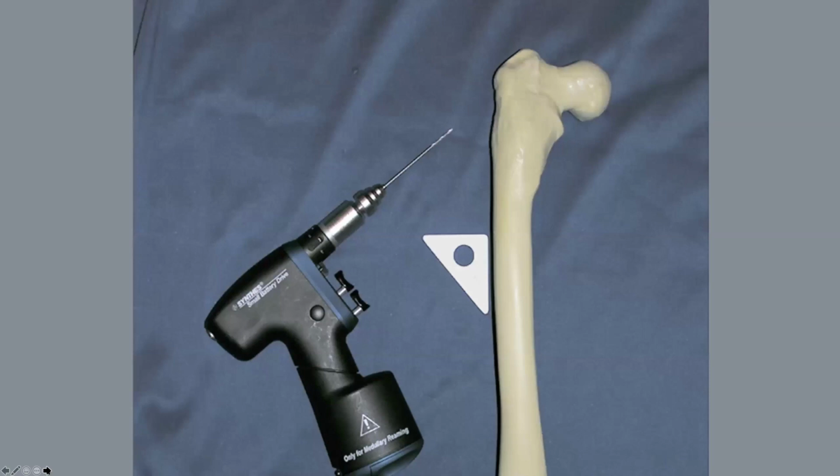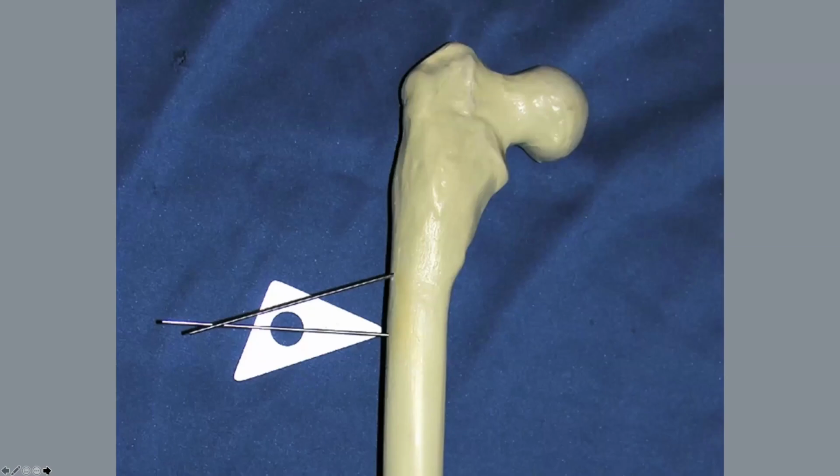The other thing I strongly recommend to you when you do this is that you use this 2mm drill bit. So this is a little bit stiffer, a little bit less flexible than, say, a 2mm guide pin would be. So you pre-drill both cortices with this 2mm, and then you take the 2mm pin and just place it in by hand or give it a slight tap with a mallet, and then make certain that it lines up at the end. And then that reference pin is what you use to make the rest of the measurements.